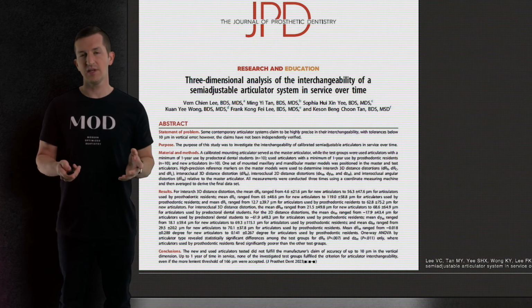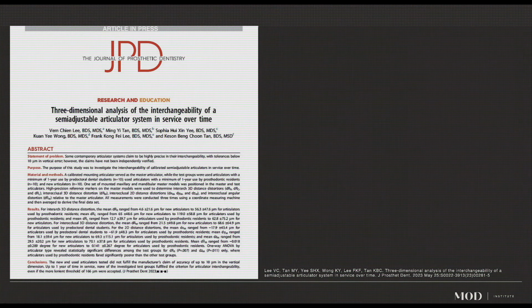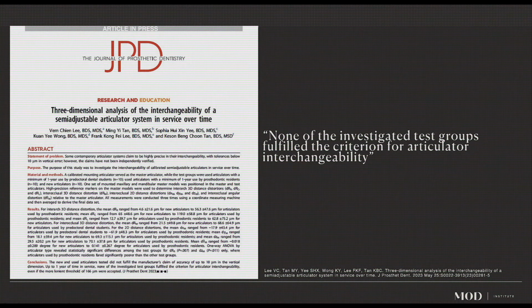The other thing to think about if you're planning cases analog with an articulator is that a recent study tried to see what level of interchangeability and accuracy there are with certain articulator systems. None of the systems that they assessed over the 1-year period maintained interchangeability for any acceptable level of accuracy.